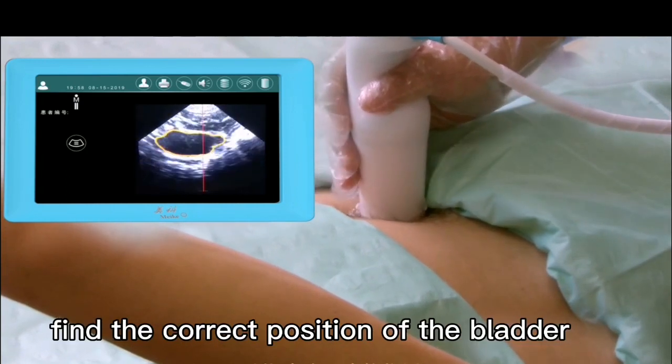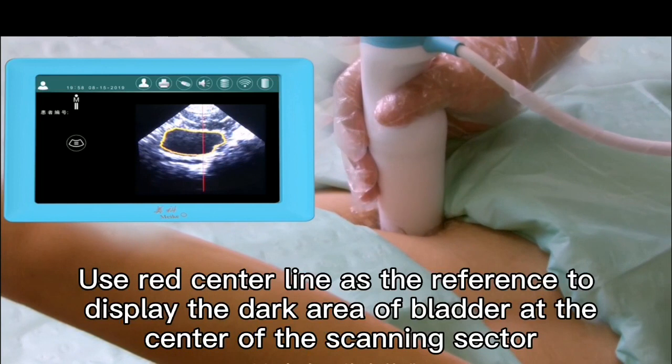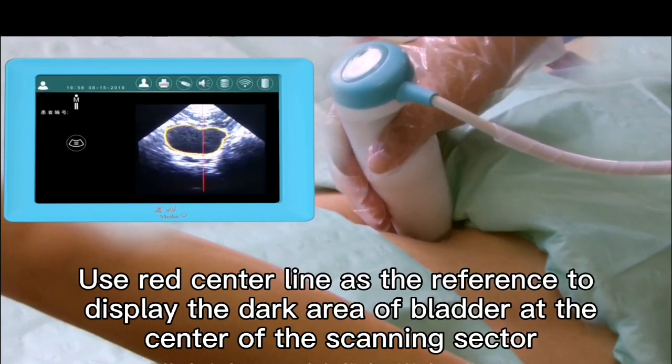Slowly move the probe left and right to find the correct position of the bladder. Use the red center line as the reference to display the dark area of the bladder at the center of the scanning sector.